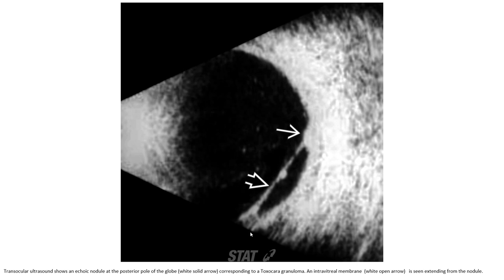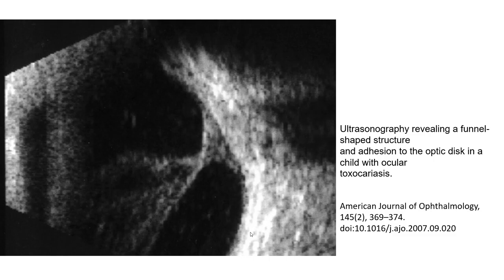This case on ultrasound shows an echogenic nodule at the posterior pole of the globe corresponding to a toxocara granuloma. An intravitreal membrane is seen stemming from the nodule. The second ultrasound case of toxocariasis reveals a dome-shaped structure adherent to the globe in a child with toxocariasis.